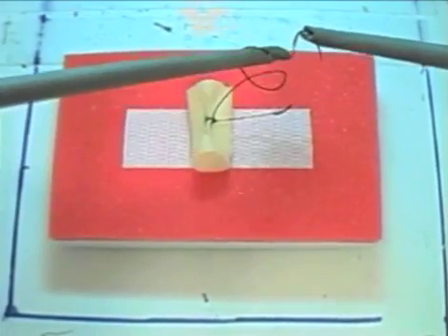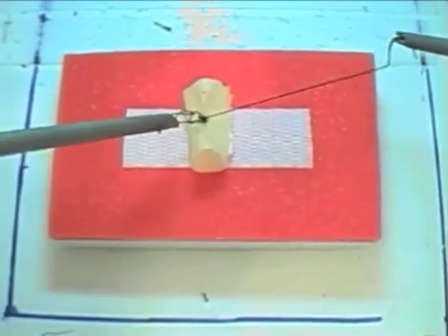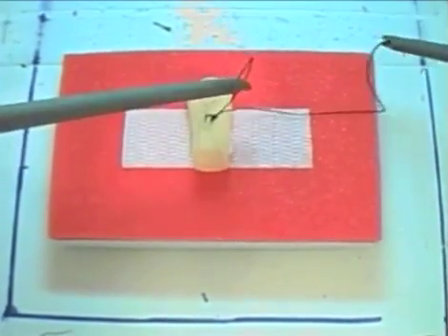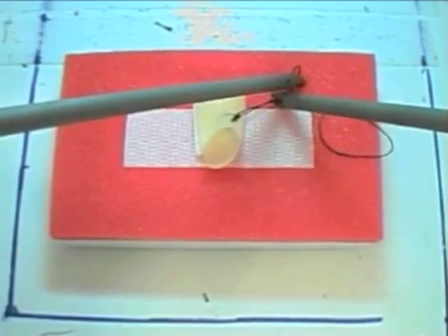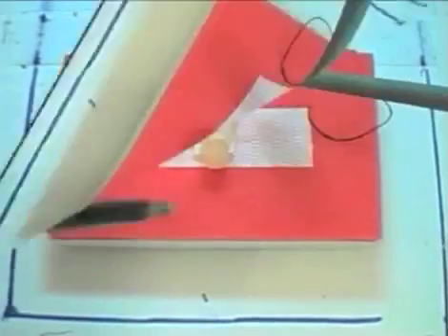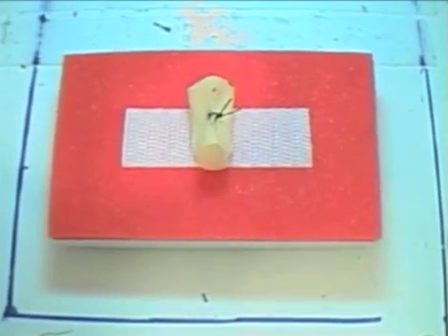The needle is transferred for the third and final throw. And the task is again completed by cutting the stitch.